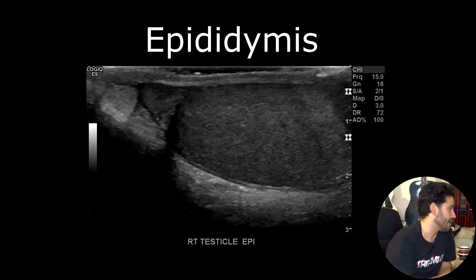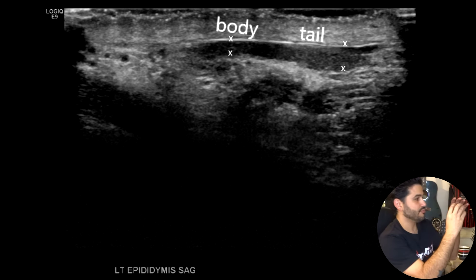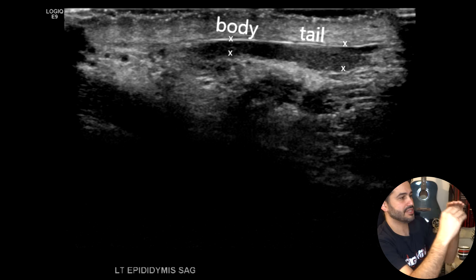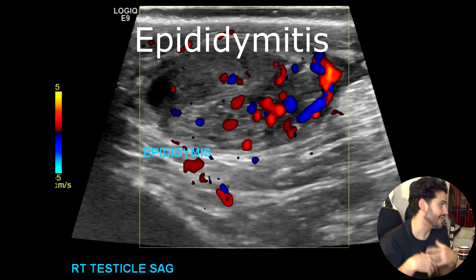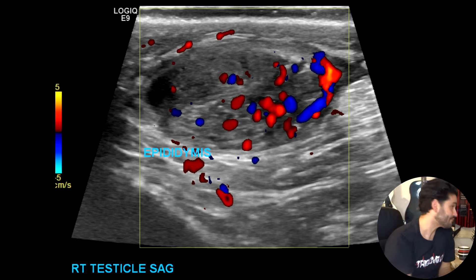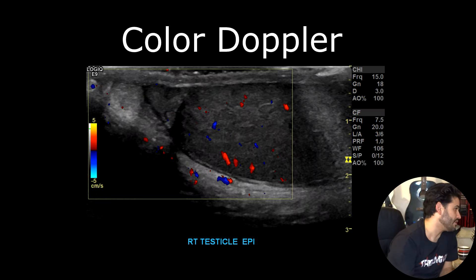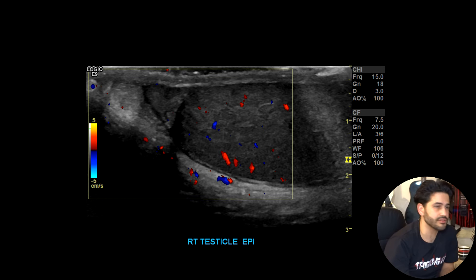Now you want to move on to the epididymis. The most prominent part is going to be the head, so you take that image at the superior pole of the testicle. The head is more bulbous, and then the body and tail get very thin, but you can still track it down. Make sure there's no epididymitis or inflammation — in that case it will be larger. You want to add color doppler to check for hyperemia. There'll also be inflammatory changes in the tissues and fat within the scrotum. A very common finding is epididymal cysts — a lot of males have them. In some cases you might have a spermatocele, so look out for those.